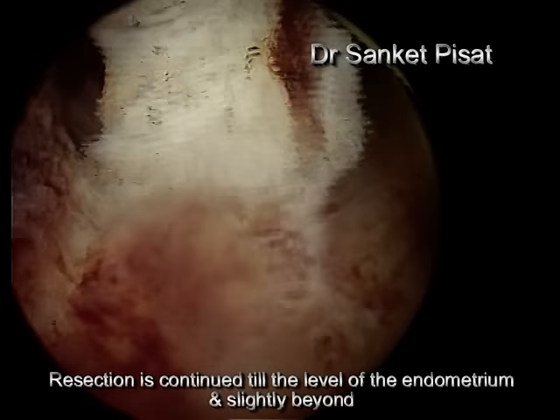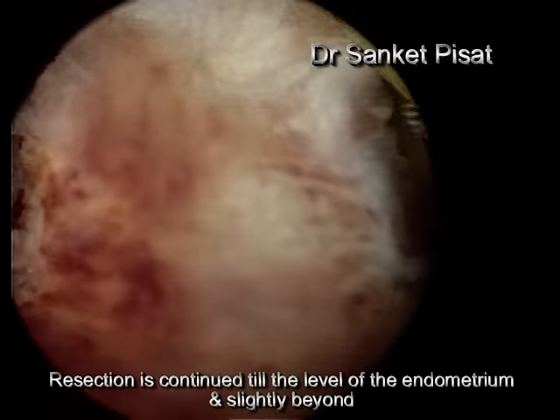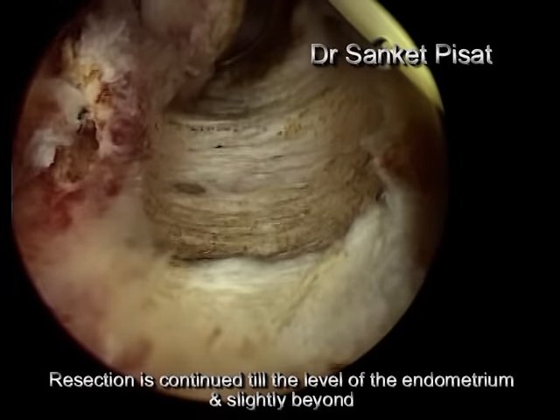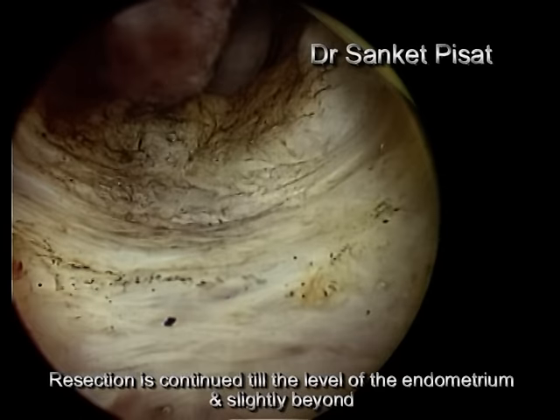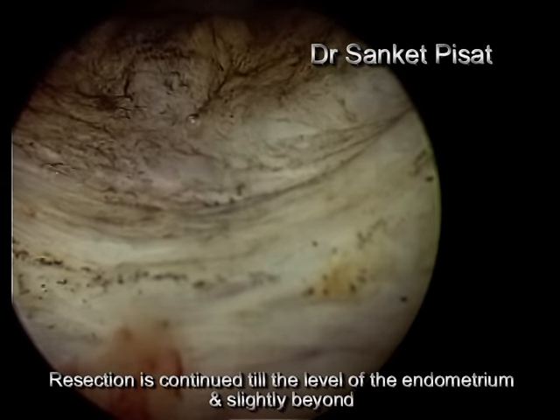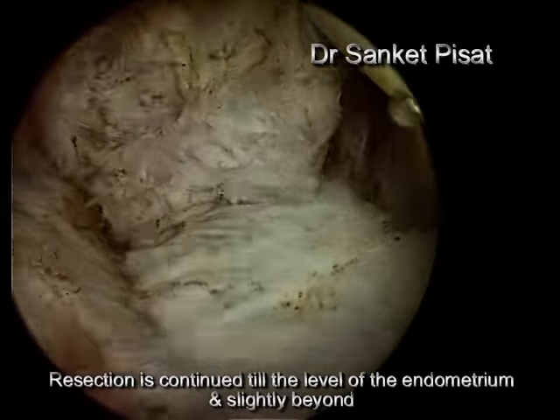Notice the difference in color and texture between the myoma and the surrounding normal myometrium. Resection is continued, taking 2 or 3 successive cuts until the fibroid is flush to the level of the endometrial lining, or even a little deeper, till the surgeon feels comfortable to continue the resection.